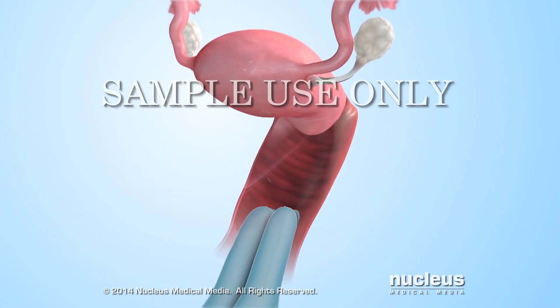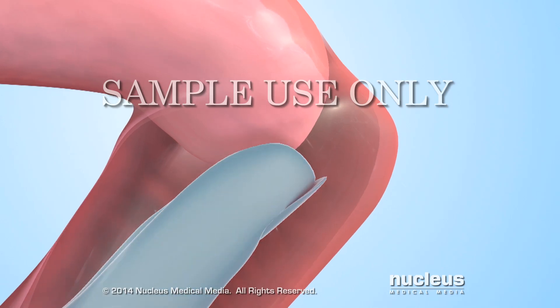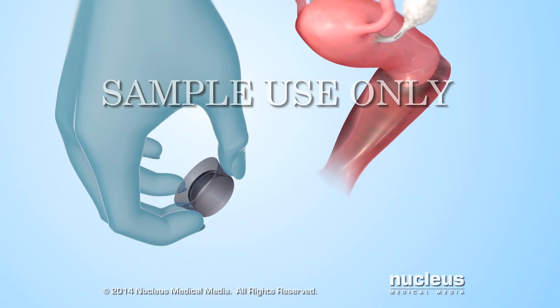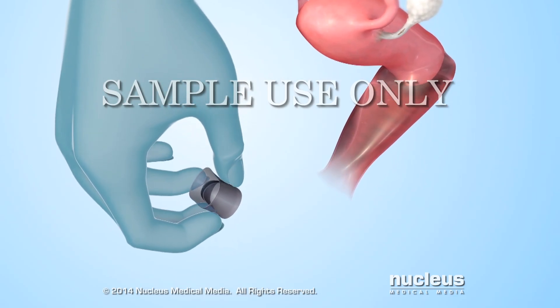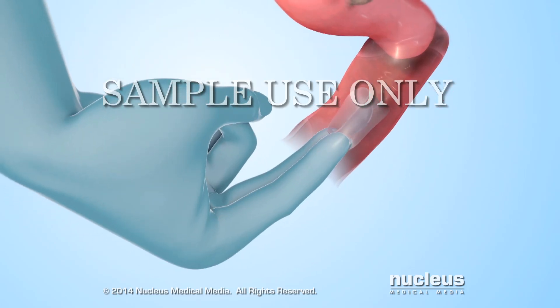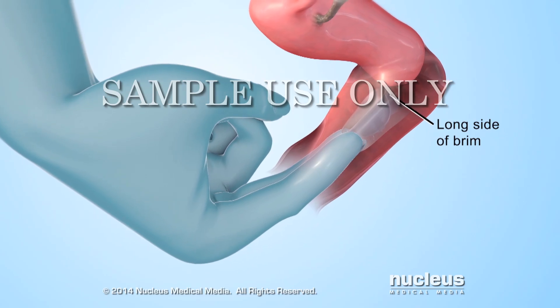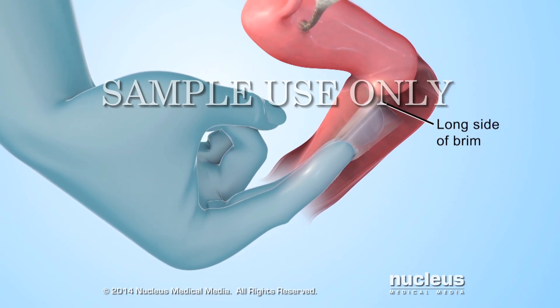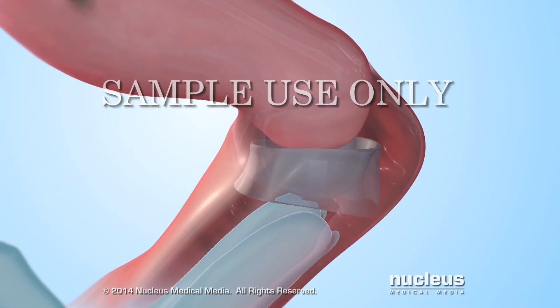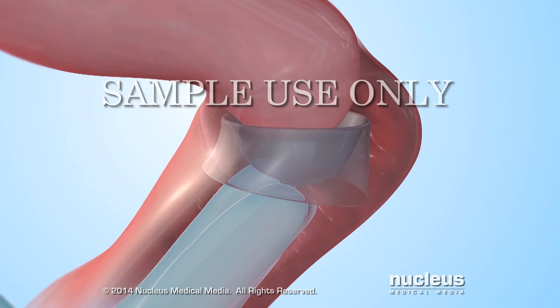Insert your index and middle fingers all the way into your vagina to locate your cervix so that you'll know where to place the cervical cap. Next, squeeze the cervical cap with the dome facing away from your vagina. Then slide the cervical cap into your vagina with the long side of the brim entering first. Using one or two fingers, slide the cervical cap as far into your vagina as it will go. Check with your fingers to make sure the cervical cap touches and completely covers your cervix.